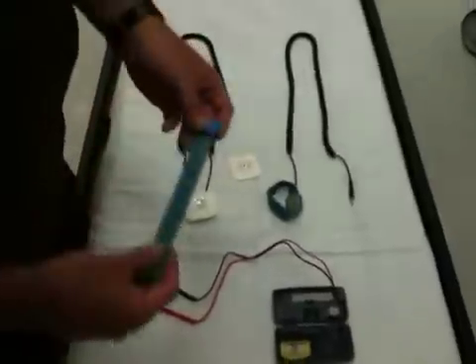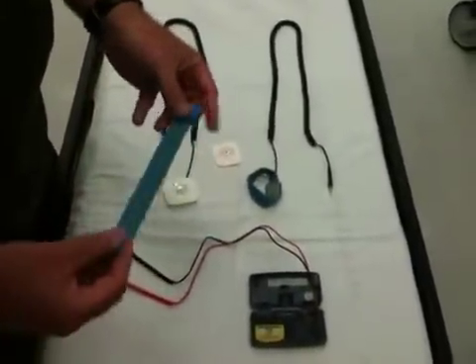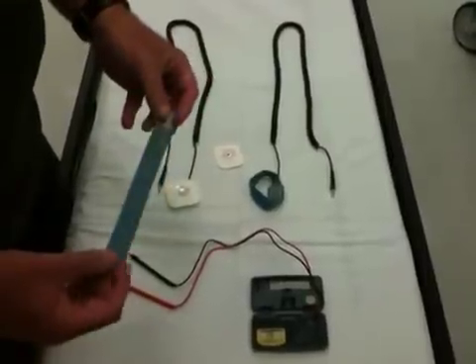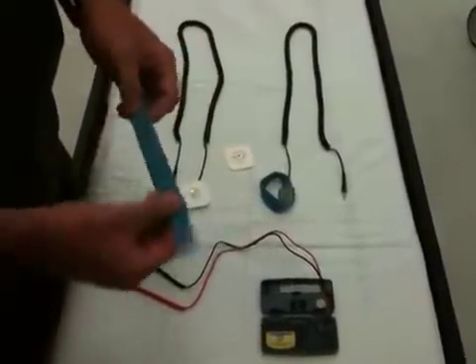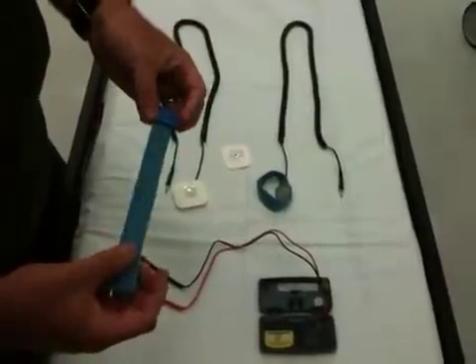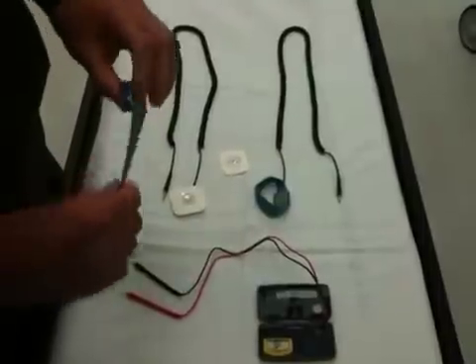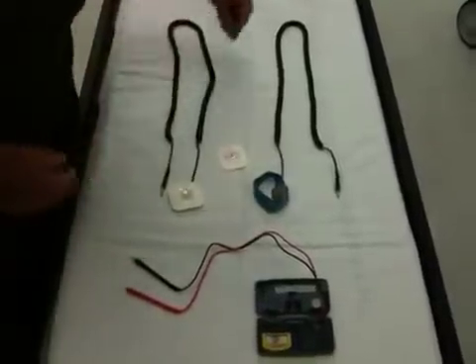One of the problems I find with these wrist straps is that a lot of centers I've been to only have a couple of these. Patients have to reuse them. They're absorbent, they're difficult to keep clean, and they wear out over time. I think it's an infection control issue and I don't like using them at all.